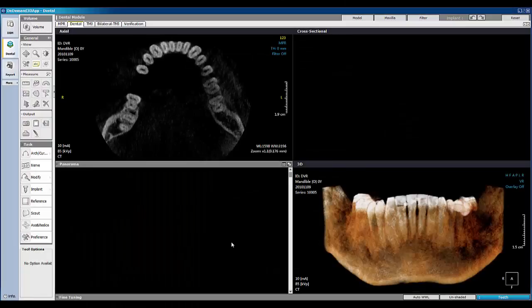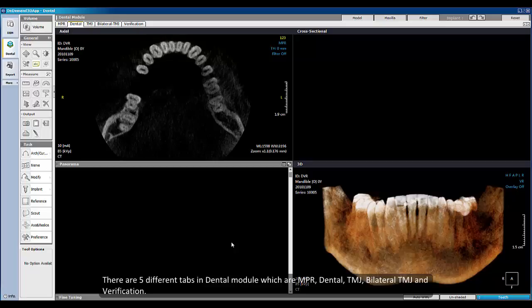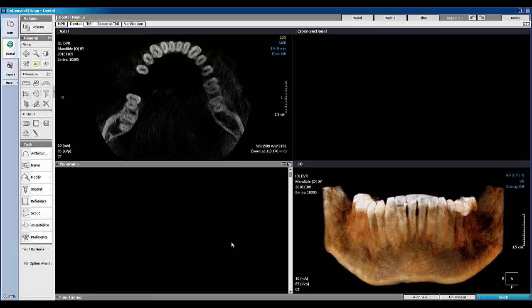Welcome to the video tutorial on On-Demand 3D software. This video will cover the dental module, which contains essential functions for better implant treatment planning and accurate diagnosis. There are 5 different tabs in the dental module: MPR, Dental, TMJ, Bilateral TMJ, and Verification. In this video, we will cover the Dental tab.